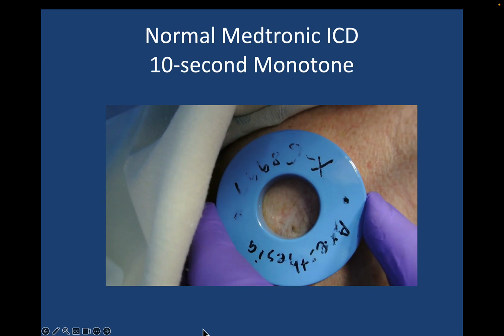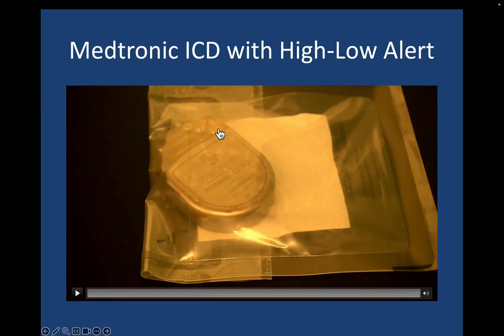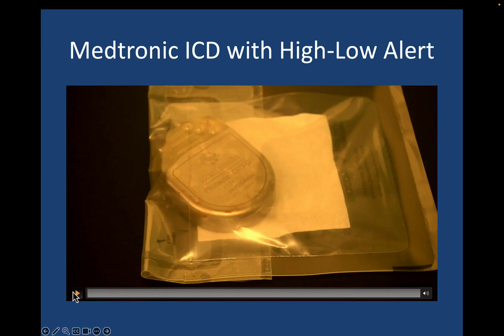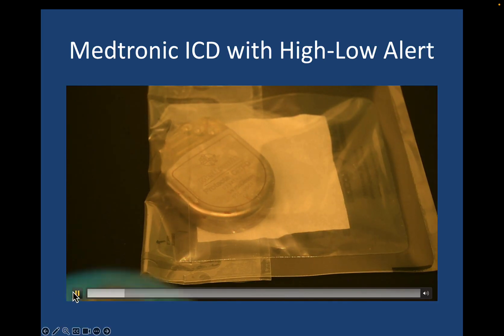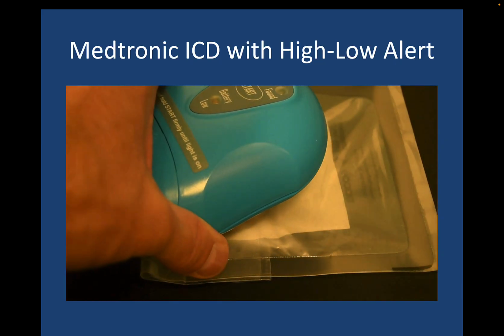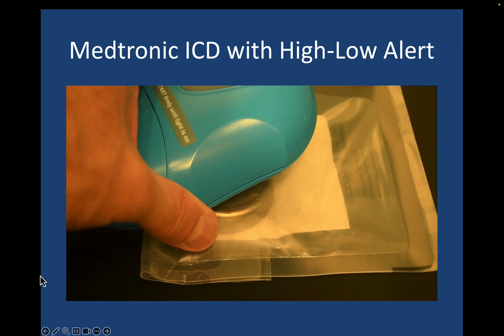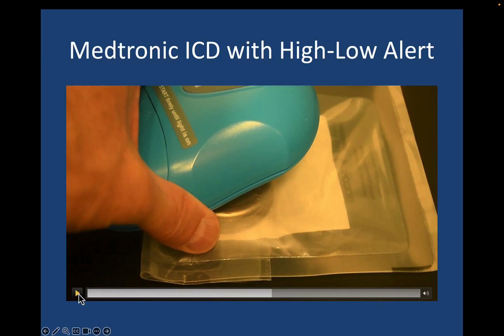Okay, so you can hear that the tone stops even though the magnet is not moved. It just lasts for about 10 seconds. This is one example of a patient who's got a clinical alert or a device issue. This is the high-low tone. It sounds a little bit like you're in Paris and there's a policeman coming by.